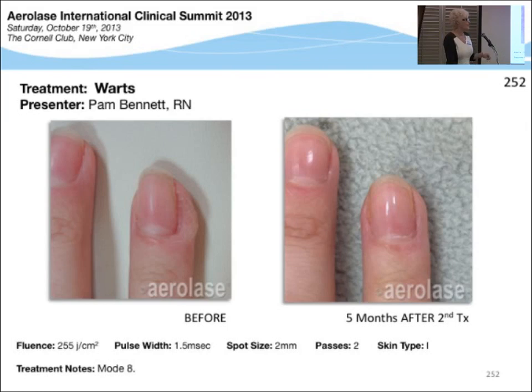And we did have to stop during the treatment several times. That's a very, very sensitive area, and your pain level there is just through the roof. We didn't numb with anything but ice, and we would do 2 or 3 shots, and then she would say, that's enough. We'd grab the ice, sit it on there for a couple of minutes, and then try again, and it worked great. How did you debulk?